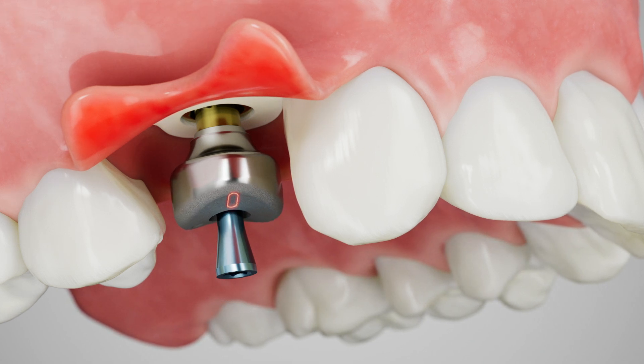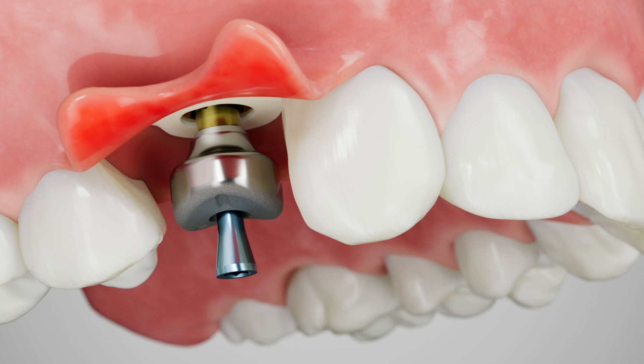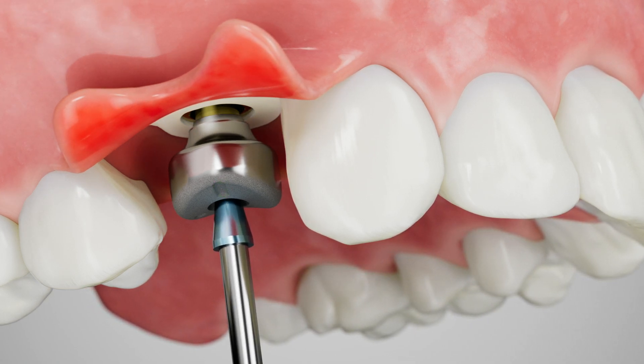Ensure the notch on the occlusal profile of the abutment is pointed towards the buccal plane. Hand tighten the abutment screw using an 050 hex driver.